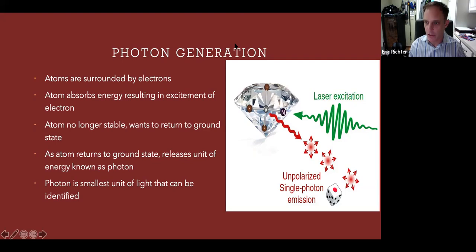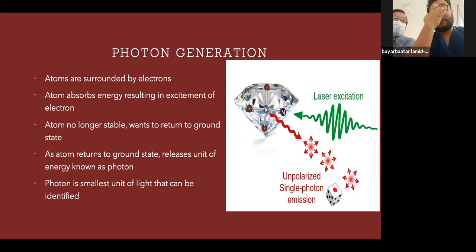So that's the very start of a laser. Essentially, the laser results when the energy source stimulates the atom to excite the electrons. The electrons then return to the ground state, as is the natural desire of the atom. When it does so, it emits the photon. And that's the start of the laser. That's the basic. The photon is the first thing that we have.